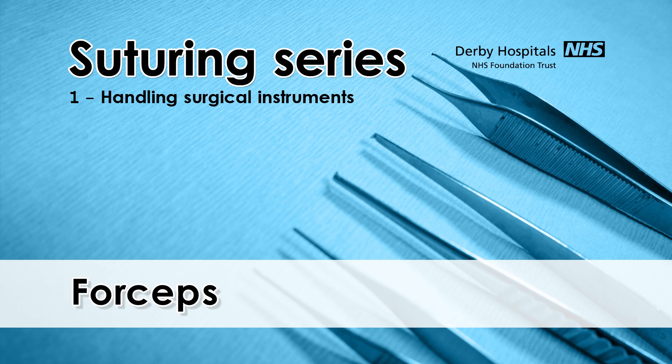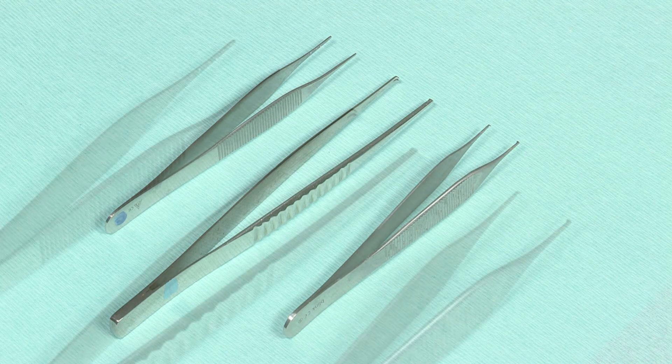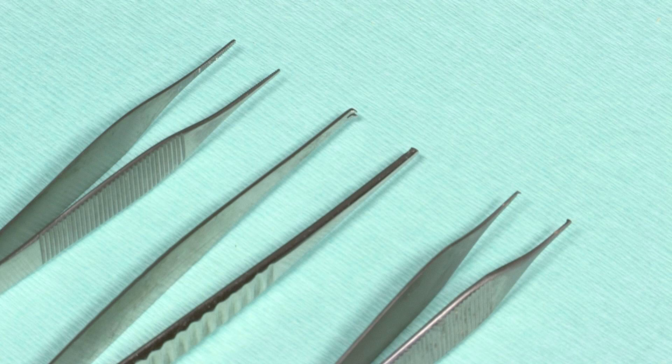Toothed forceps are the default option for skin. The teeth at the end of the forceps are for holding this firm tissue with a minimal contact area. Some forceps have a milled area for grasping a needle. In non-toothed forceps the milling travels horizontally and won't hold a needle securely. These forceps are used for tubular structures such as vessels, ureters, and friable tissues such as the liver and spleen, as they have a larger contact area to distribute the applied force. However, these forceps are more traumatic for tissues as more pressure is required to hold the skin. DeBakey's forceps are non-toothed with vertical milling and will hold a needle, as well as being more gentle on the tissues than standard non-toothed forceps.